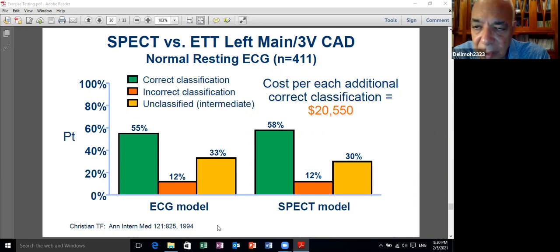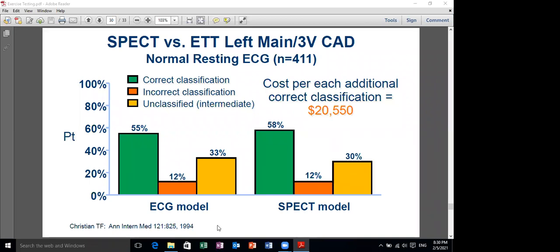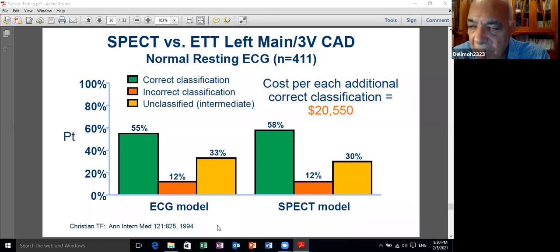العيانين بعد الاكسرسايز تيست بننيمهم على طول. الدكتور يحيى سعد كان برضه بيقول بنقعدهم الاول. ليه بننيمهم على طول؟ لانك انت لما بتنيميهم على طول الانكريزد فينس ريتيرن بيكمبريس الاندوكارديوم، والكمبريشن بتاع الاندوكارديوم ستينوزس اوريدي اسكيميك وبيكون مور اسكيميك.